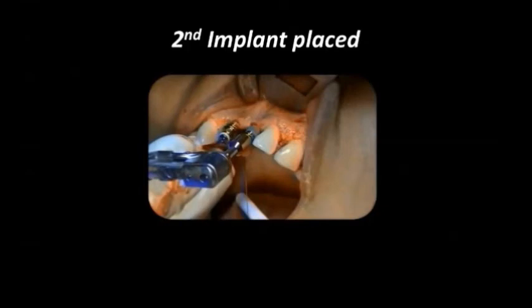The first implant has been placed and the second implant has been placed, and you can see on the buccal side that the bone is very thin and it's shining through the implant. You can see the grayish color of the implant going inside the bone. We do this at a very low speed in order to keep the bone intact. We don't drill with a fast speed, to avoid overheating, and we try to always keep the insertion part of the implant in order to guide us in a parallel way.